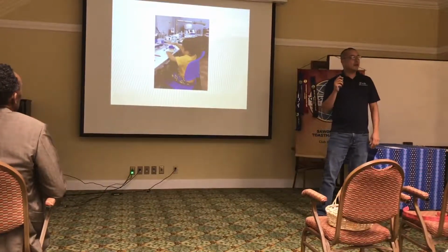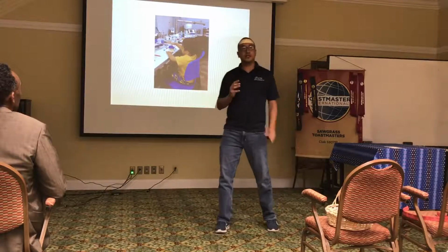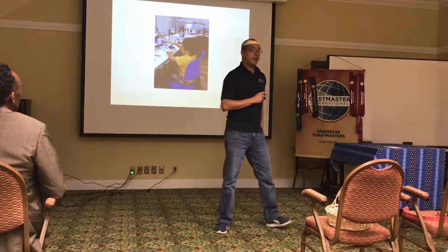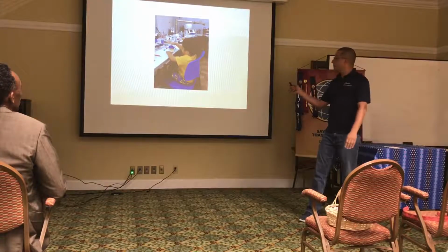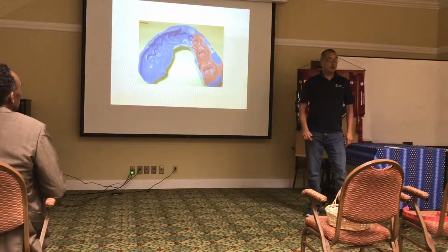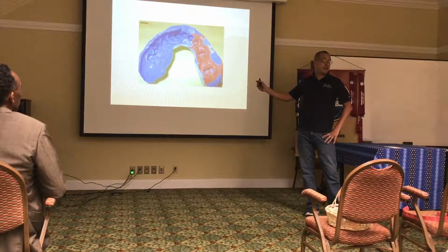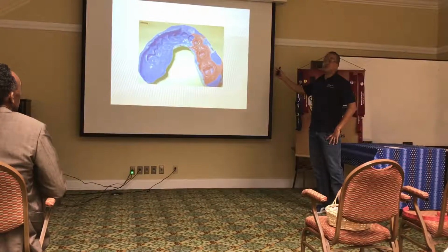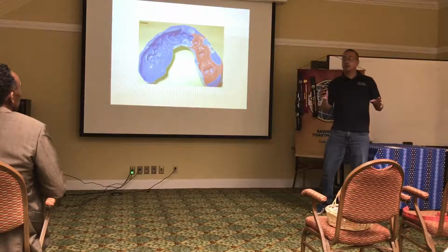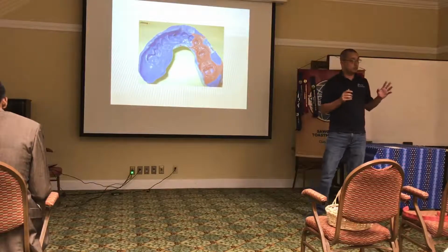And for every restoration that we make, there is a dental technician that takes everything to the lab. So everything starts from the impression. How many of you had this in the mouth? And you guys like, oh, I hate this part. But we need it. We need to inspect the impression to make sure that all the impressions are good so we can do a good work.